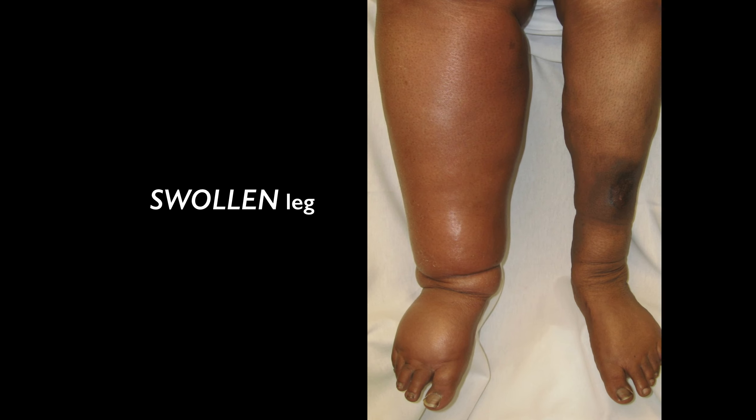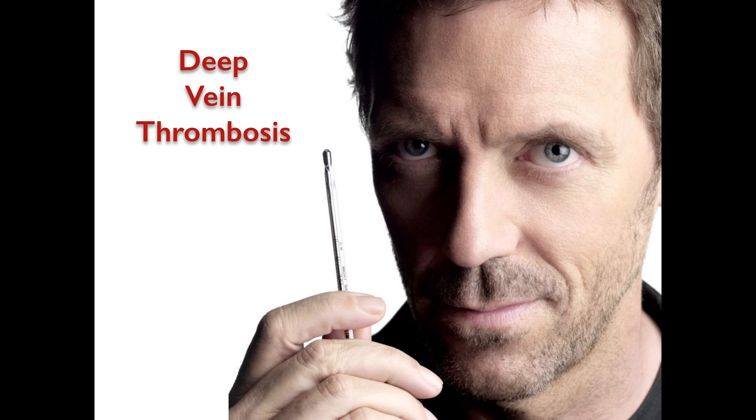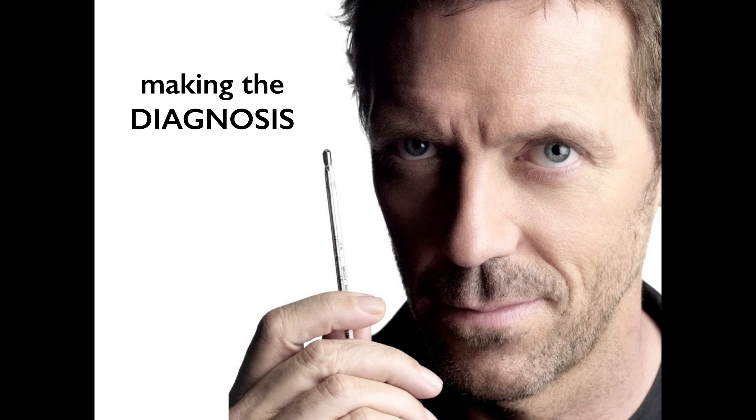When you encounter a patient with a swollen leg, either unilateral or bilateral, the differential is always going to be: does the patient have a blood clot or not? In general you're trying to differentiate between cellulitis versus DVT, or other causes of edema such as CHF or venous insufficiency. For this talk we're going to focus on deep vein thrombosis of the lower extremity and how to make the diagnosis with ultrasound.